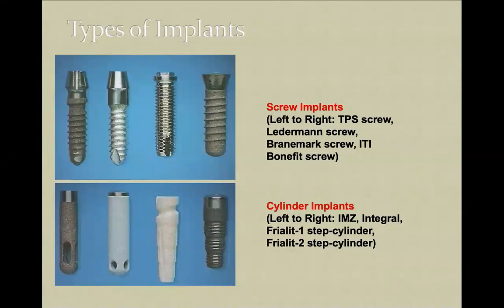There are specific systems that should not be discussed today, that should be discussed in your 5th year of education. It is all-in-4 concepts, and zygoma implants that are long enough. For example, the maximum length of a zygoma implant is 53 millimeters.